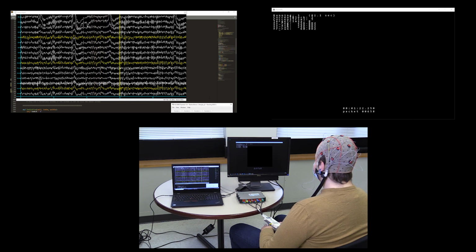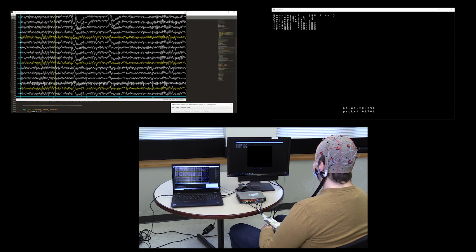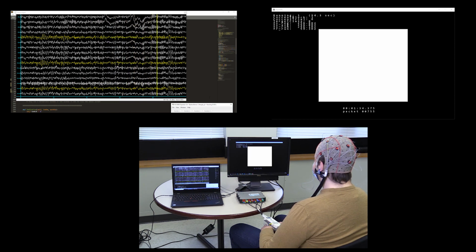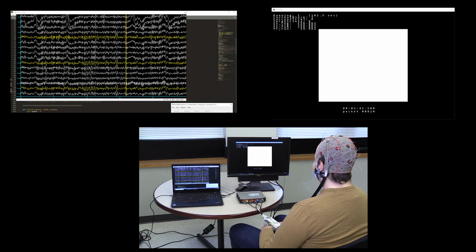For example, you could choose to have a C++ signal source module for your amplifier supported by BCPy2000, pipe that through a MATLAB script which does real-time signal processing, and display all of the stimulus and feedback through a BCPy2000 application module.